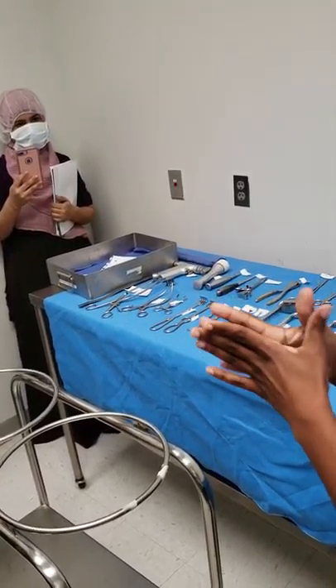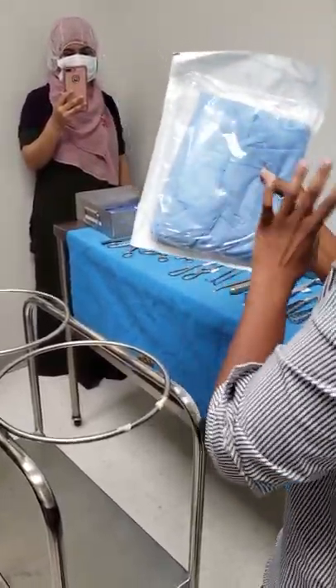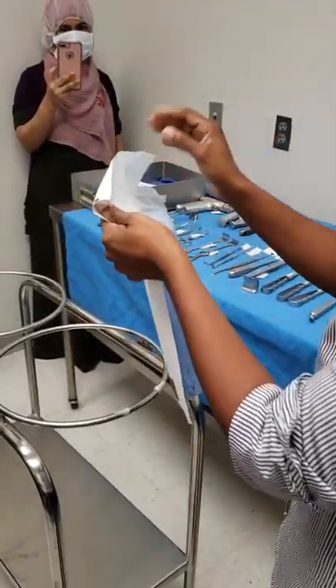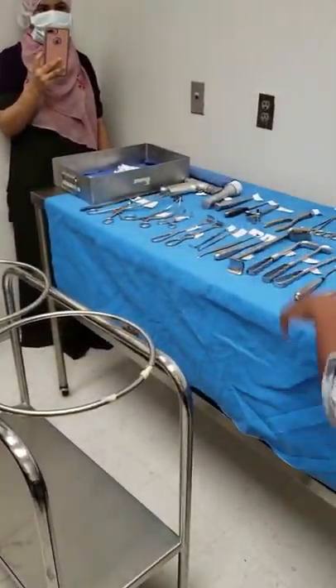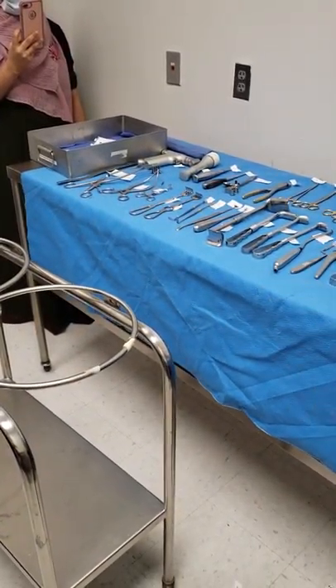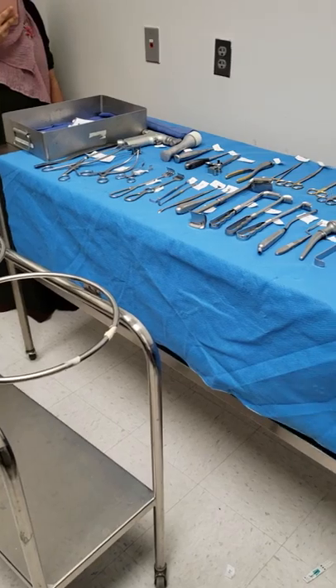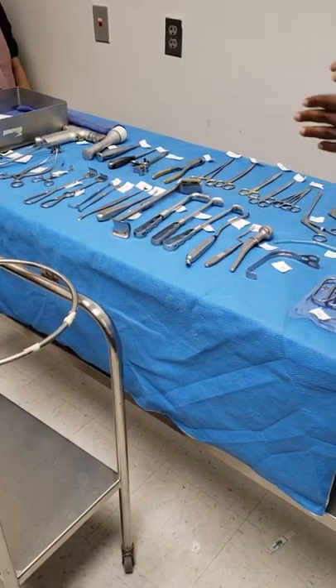So now my mask is up. The first thing I open up is my back table. Before I even open up the back table, I'm going to take the package and check the integrity. The back table cover is encased just like this gown is. You lay it on the table and open it up. Am I grabbing anything in the middle of it or am I grabbing the edges? Edges. I'm going to open it up from the edges.